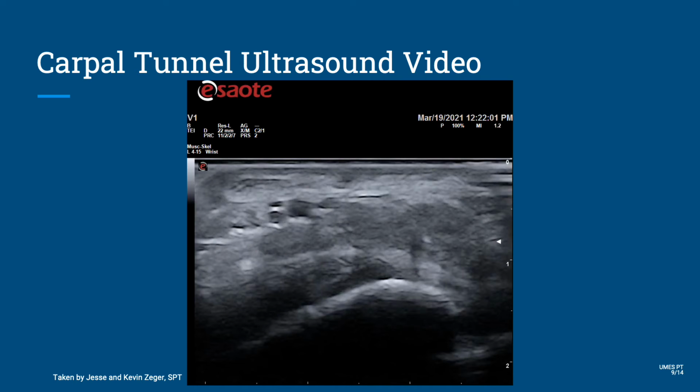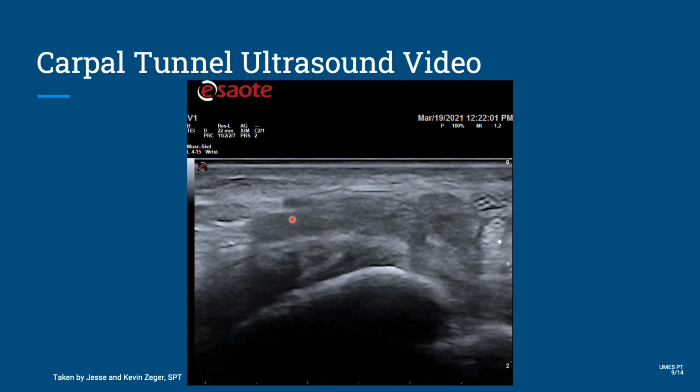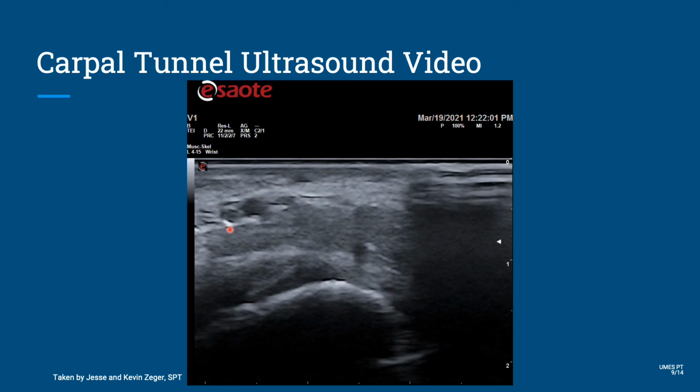This is an ultrasound video of the transducer sitting on top of the carpal tunnel. It's going to sit there for a prolonged amount of time and then add a little bit of compression. I want you to notice that with prolonged observation, the ulnar artery can be seen pulsating, and with compression of the transducer, the ulnar veins disappear. It's right there. You can really see it pulsating when it gets compressed, and then the veins come back.